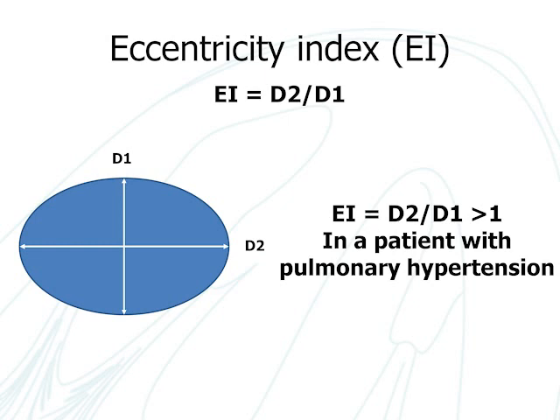The eccentricity index is a measure of the degree of distortion of the left ventricle, and it can be calculated from the short axis view at the level of the left ventricular papillary muscles. It is calculated by measuring the minor axis of the left ventricle parallel to the septum, D2, and the minor axis of the left ventricle perpendicular to the septum, D1. The eccentricity index is calculated by dividing D2 by D1.